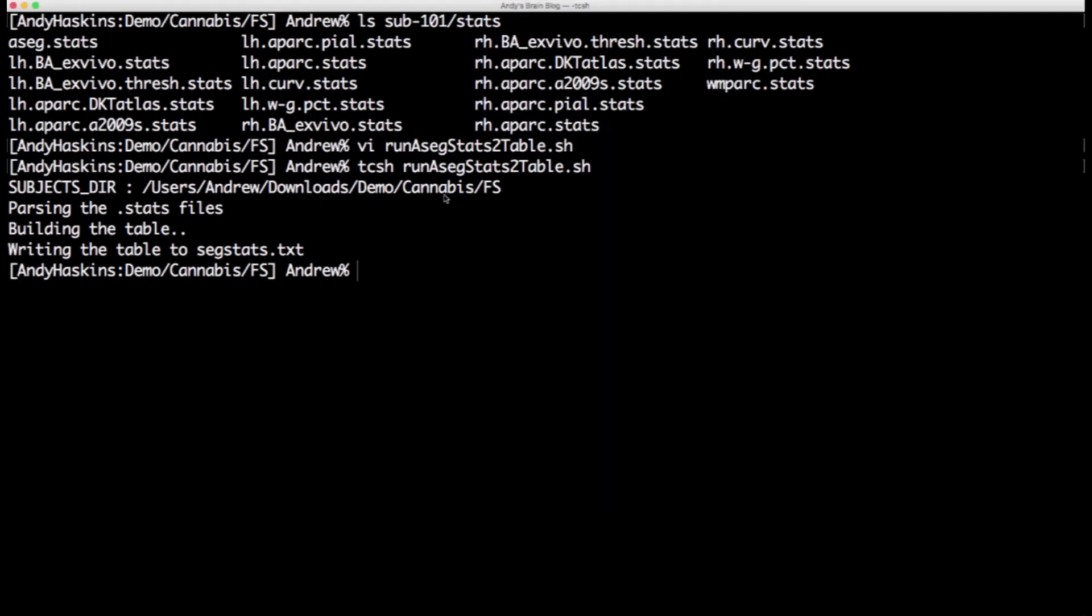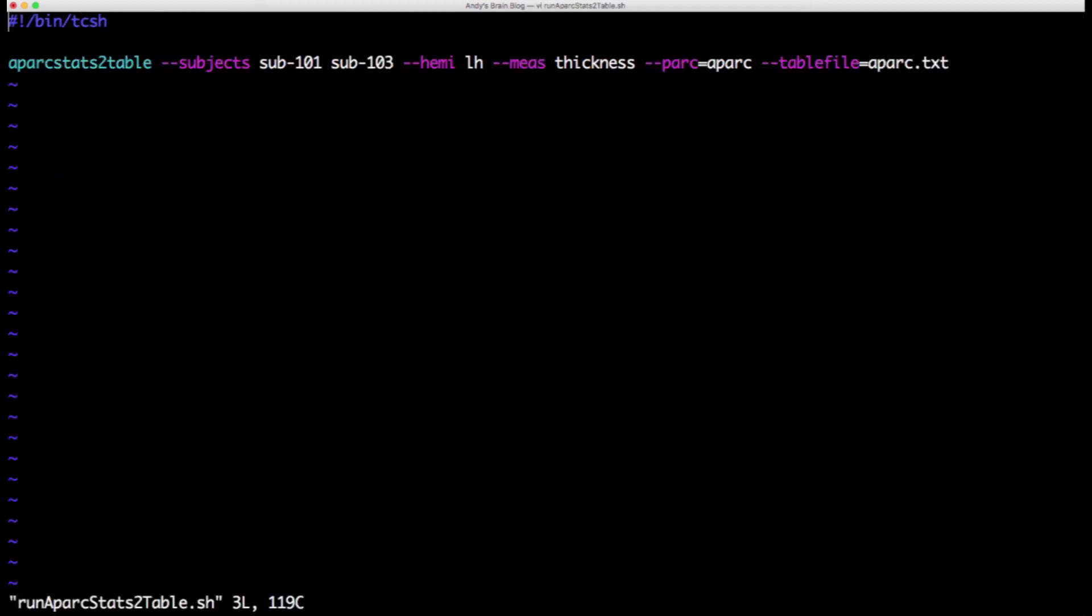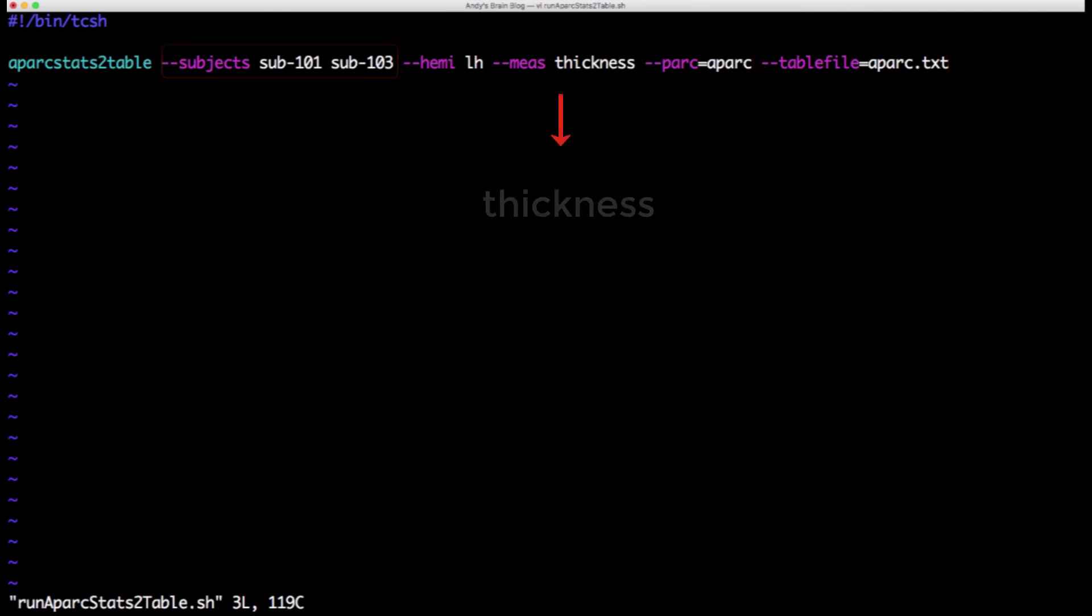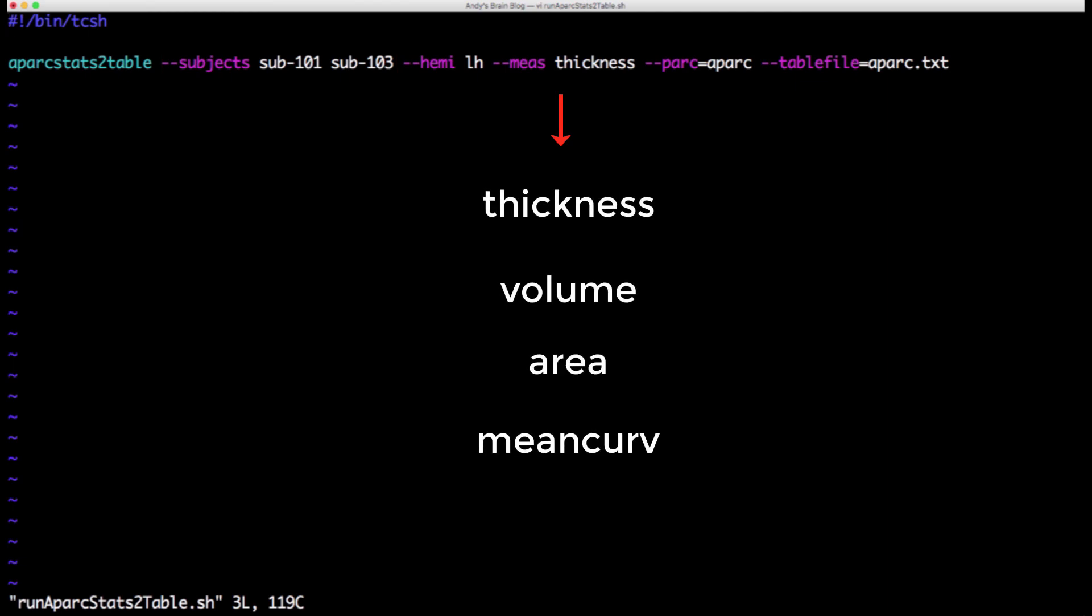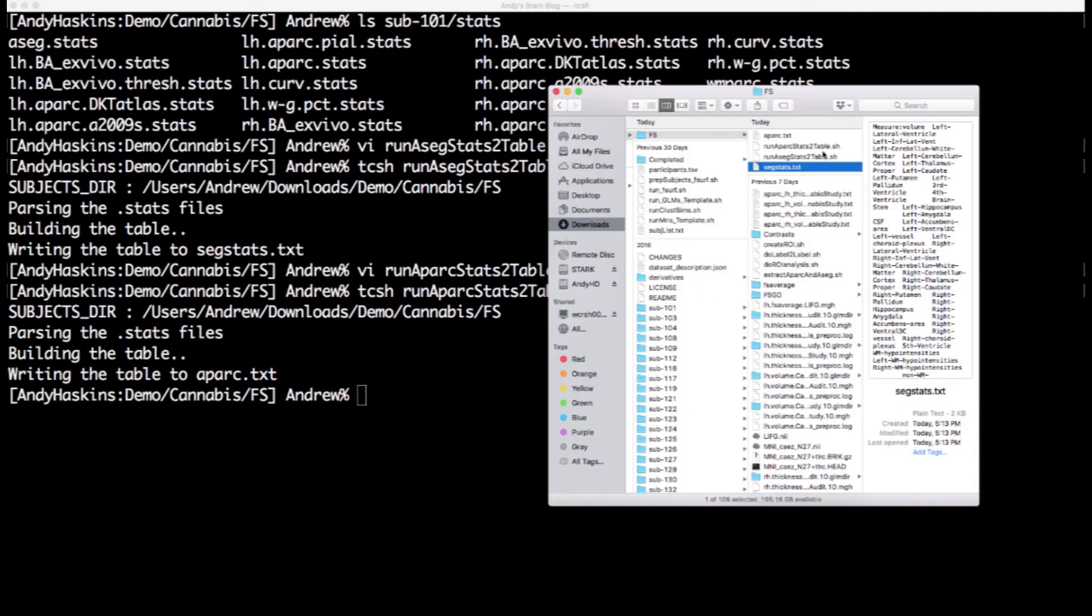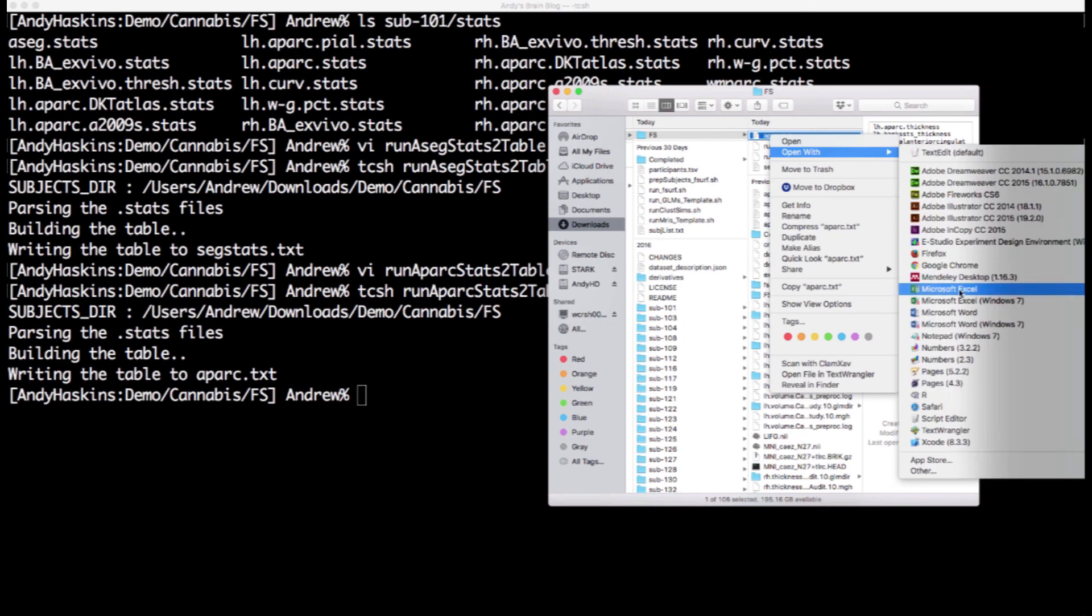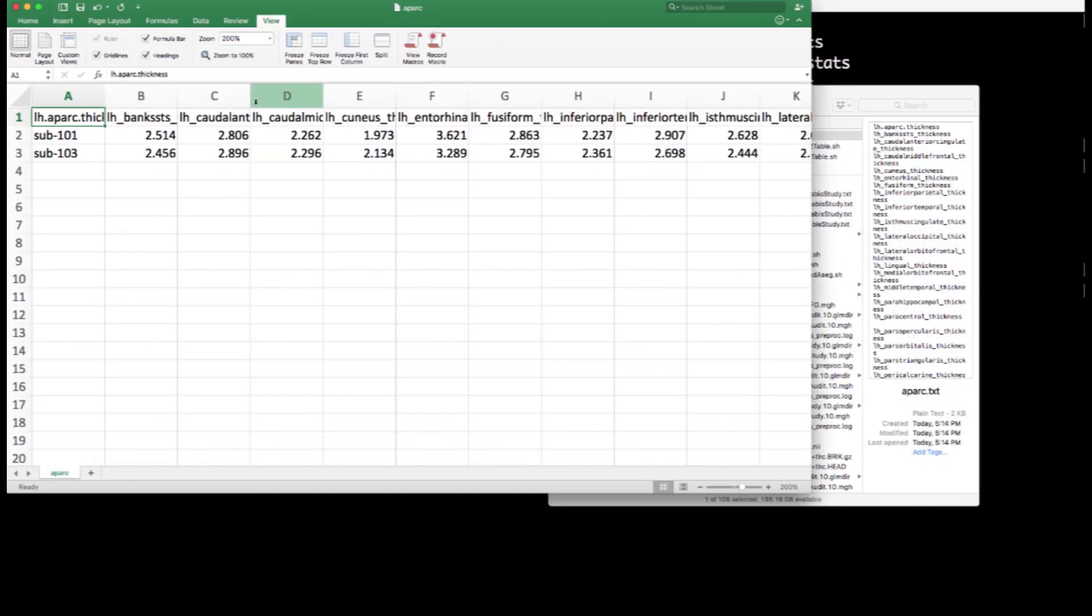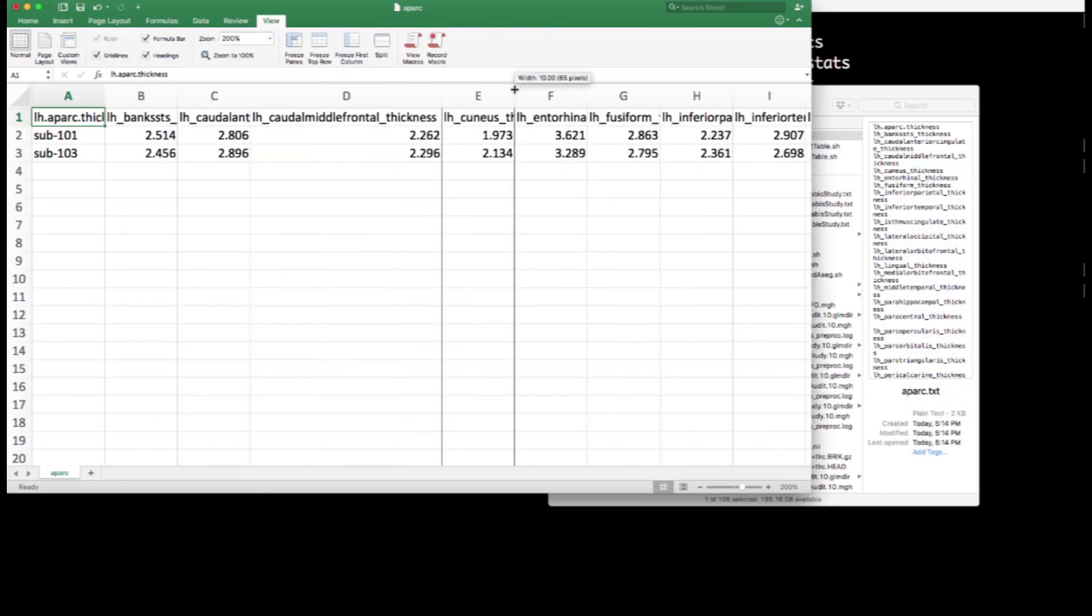We use a similar approach with the aparc stats to table command for the parcellations. The inputs are a list of subjects, the hemisphere to extract from, which parcellation atlas you wish to use, and a name for the output file. The measurement extraction options are thickness, volume, area, and curvature. You can then organize the resulting spreadsheet to run statistics as you like.